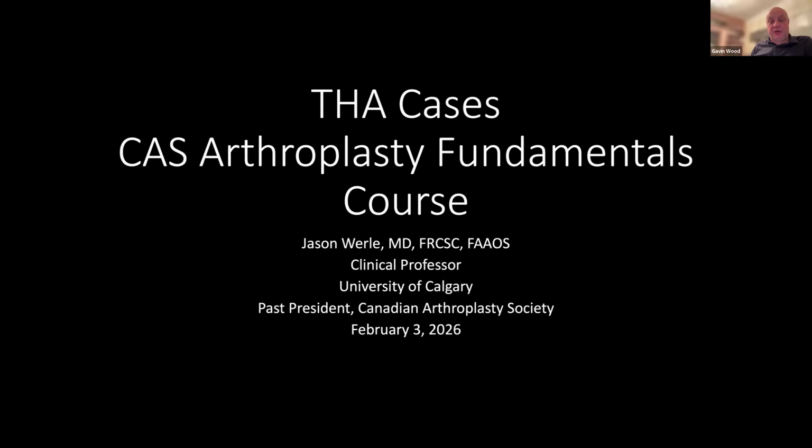I think I'd agree with you with the hip. I think we know what we want to do in center of rotation and offset and leg length, and computers or robots can help us reproduce that. But I think we still have some way to go to figure out where we're putting the knee replacement. There are all these various types of alignments, kinematic, restricted kinematic. The robot will only put the implant where we think it's got to go, and I don't think we've quite answered that question yet. Would you agree or disagree?